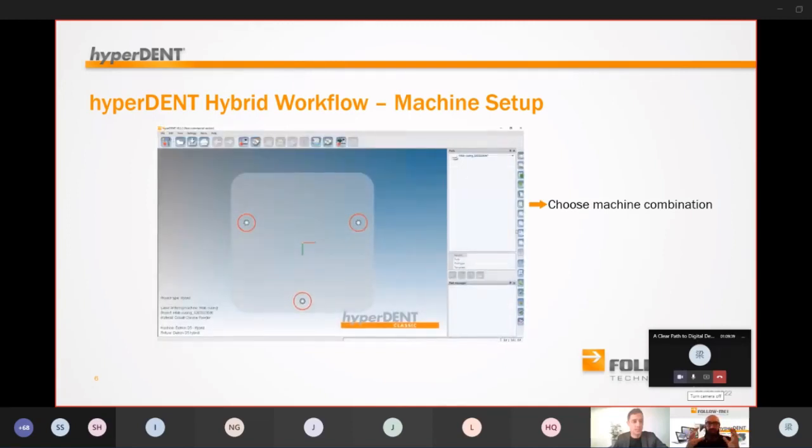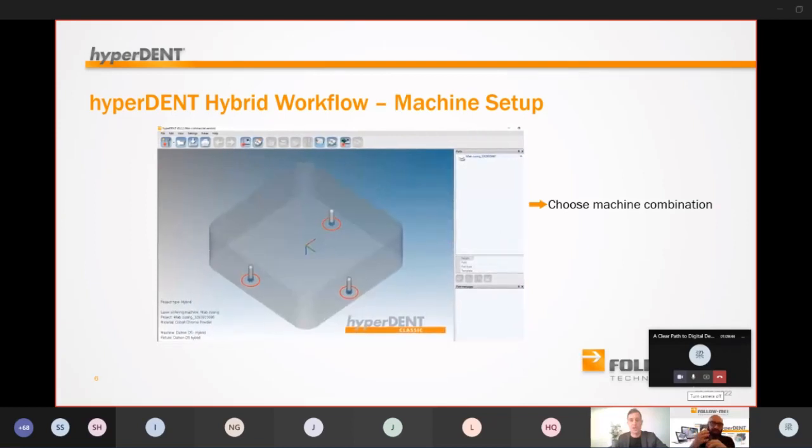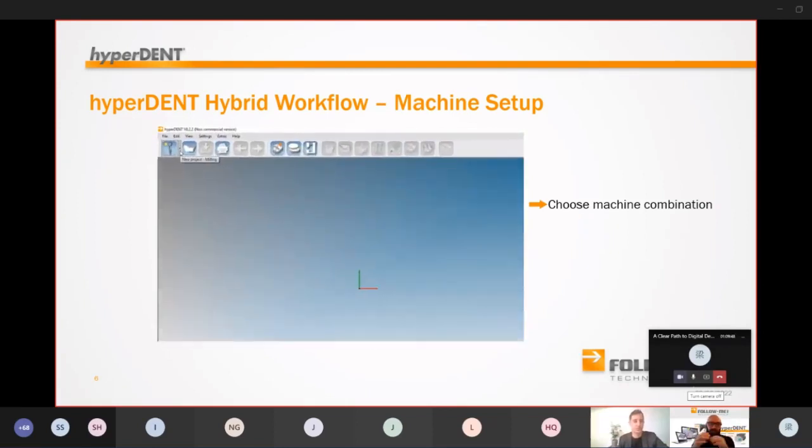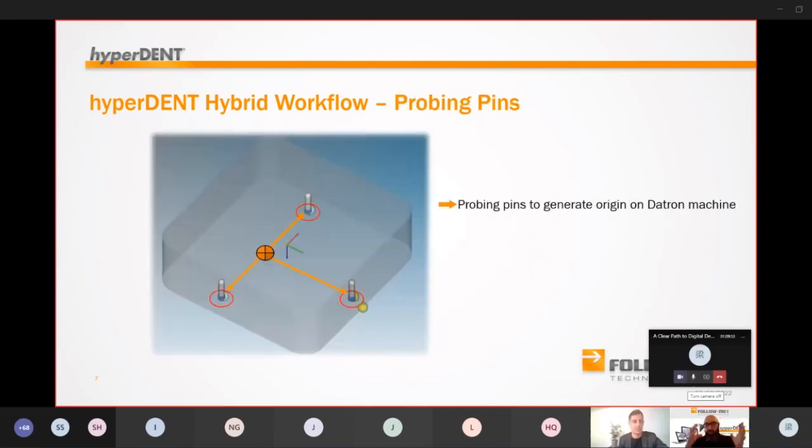In our case, I took like an example, HBD 100D and Datron. Datron C5 or D5 machines, that doesn't matter. So as we already know, after printing, the platform we should install in the machine. How to position this? How to install this platform absolutely flat, absolutely accurate?